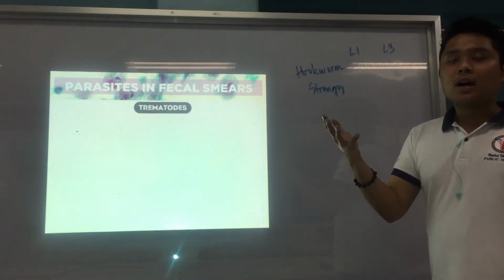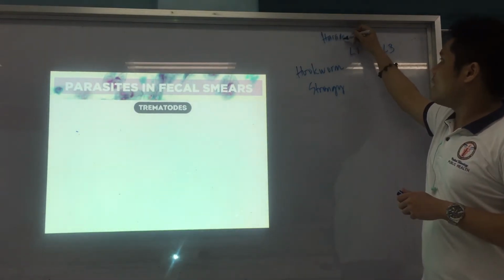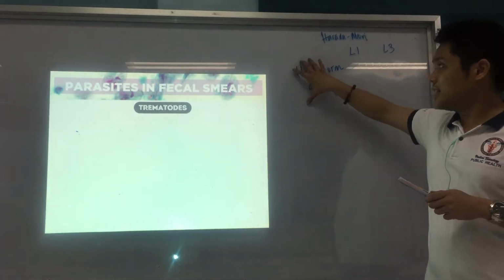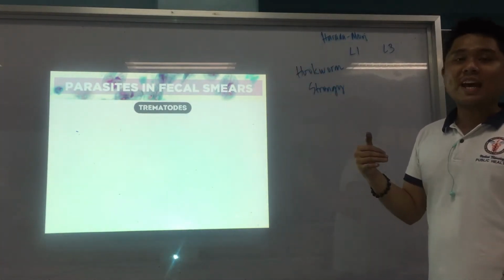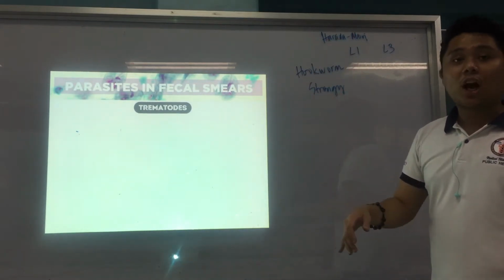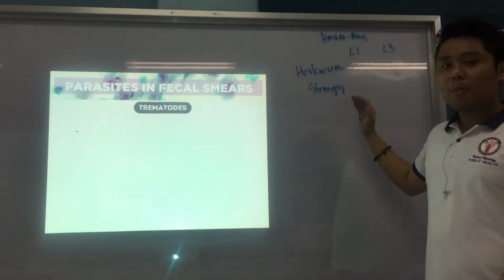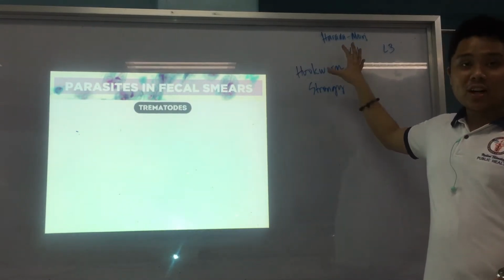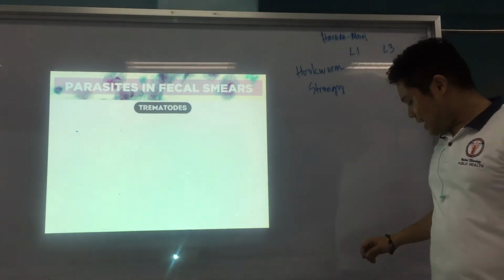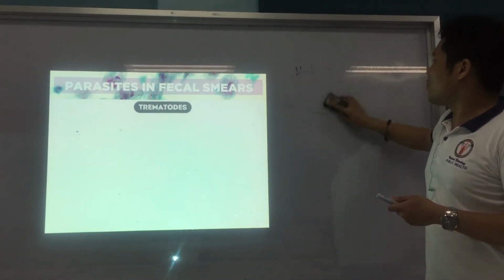When we go now to Harada Mori, which is a culture method for these two, particularly hookworm and strongy, in that presentation or lecture, I'll discuss the different characteristics of their larva and how to differentiate. But for hookworm and strongy, again, later na siya na discussion, okay?